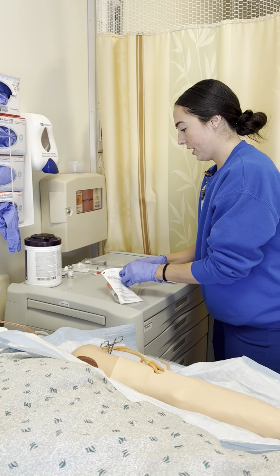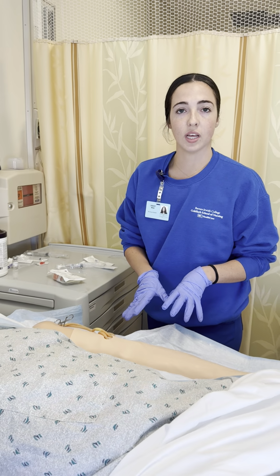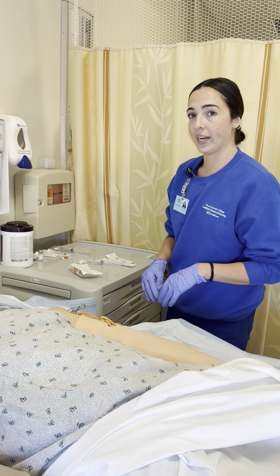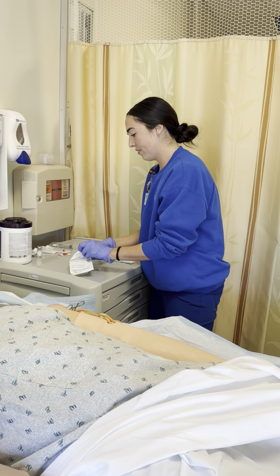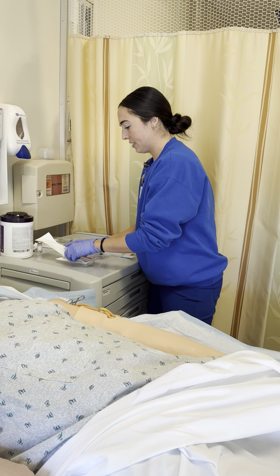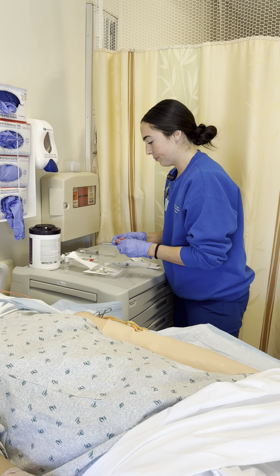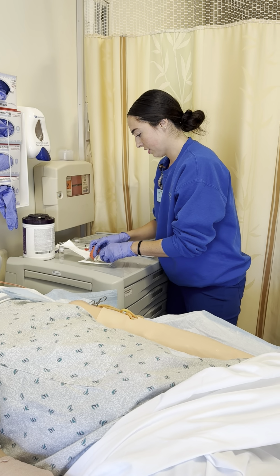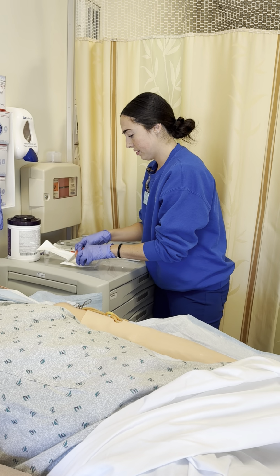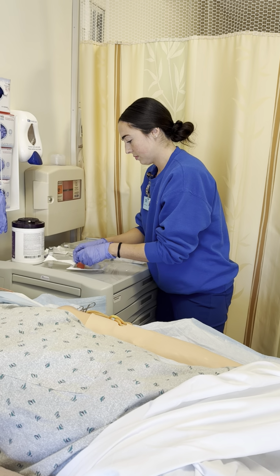Alright, so I'm going to go ahead and get started here. Again, we spoke with Ivy, we're going to do the left arm. There's no reason that we are unable to use this arm. So in our IV kit, let's get it open. Got a few supplies: I've got my tourniquet, my chlorhexidine, some tape, and gauze.